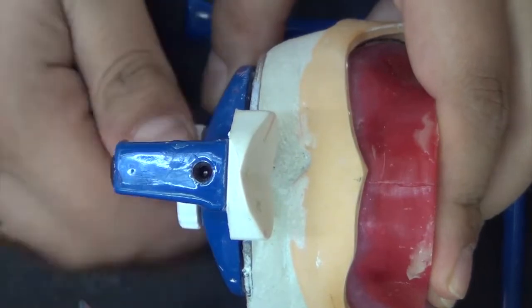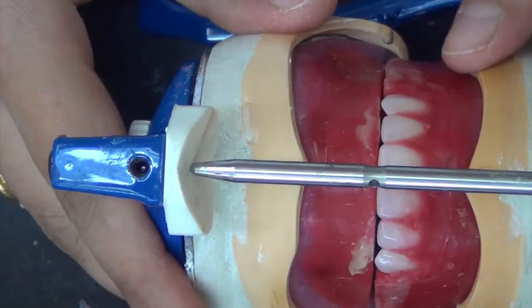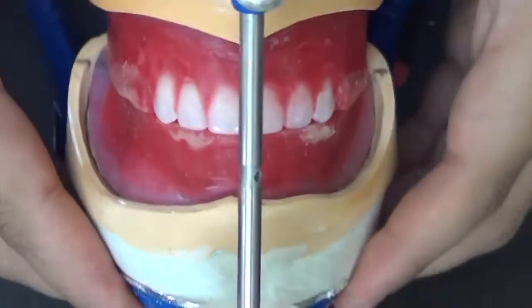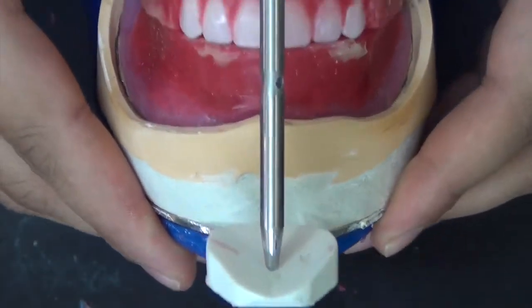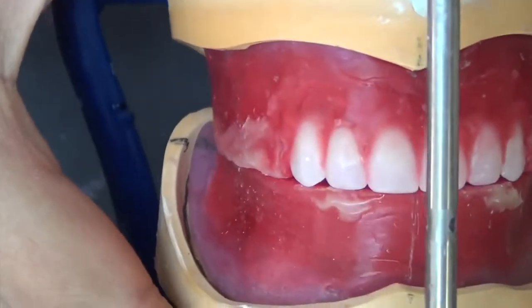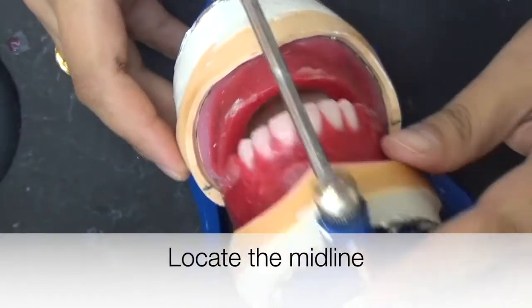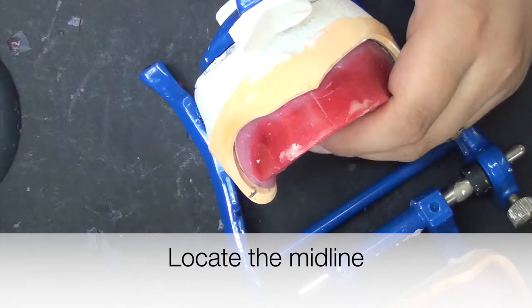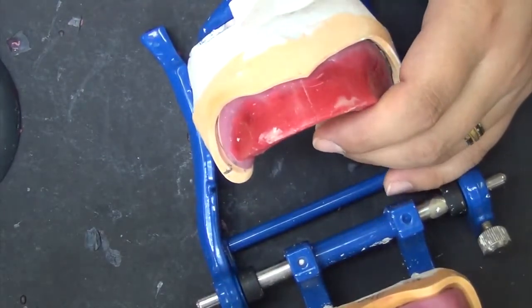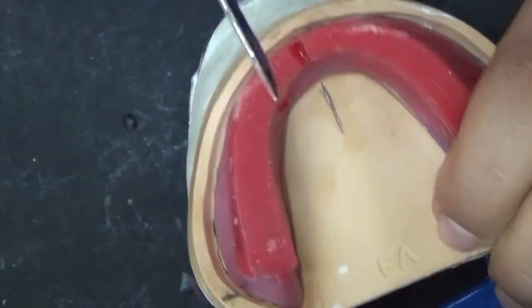You have the midline located with the upper teeth, and you know the minimal overbite and overjet you want to create. The central incisors are set at the midline and tipped slightly to the labial. Direct the long axis of the tooth toward the residual ridge.